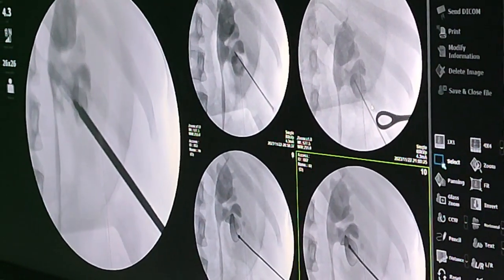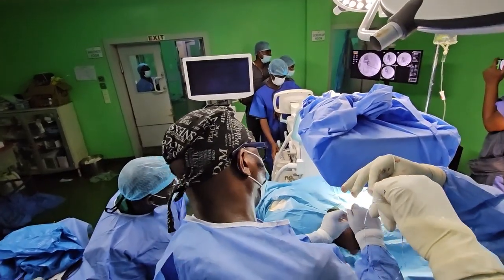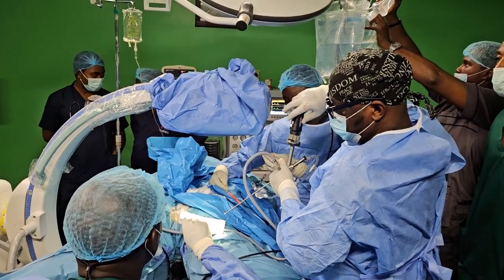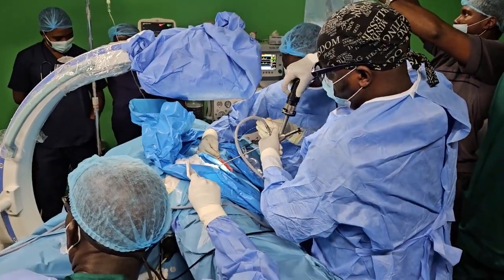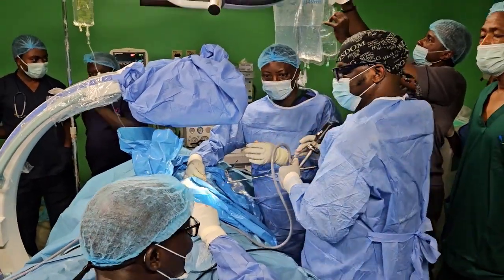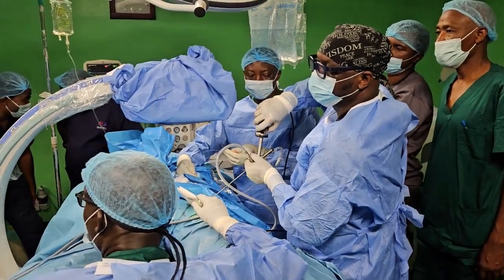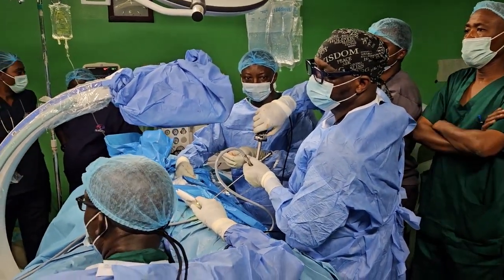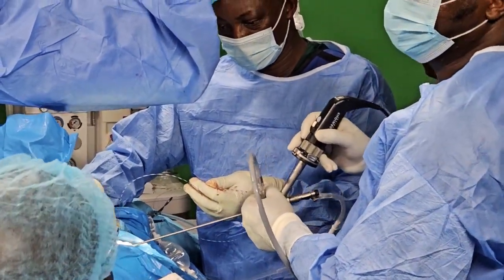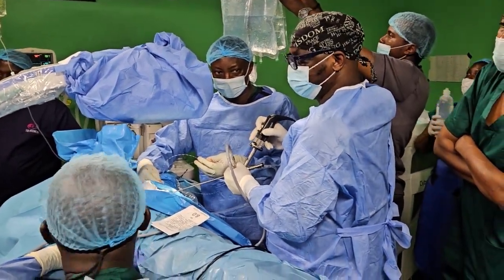Don't forget, this is the... Reduce the light. 80% is too much. Sure, it's not stable. Yes, sir.